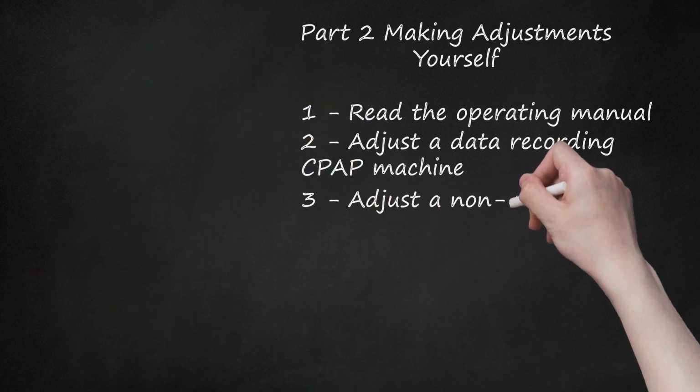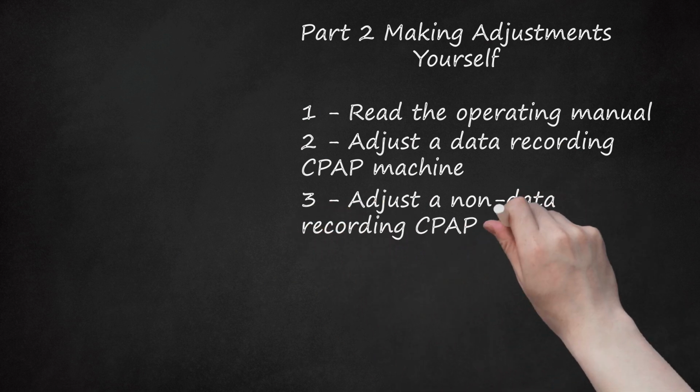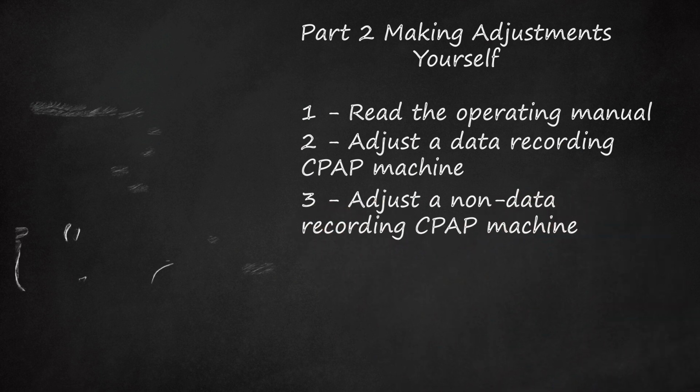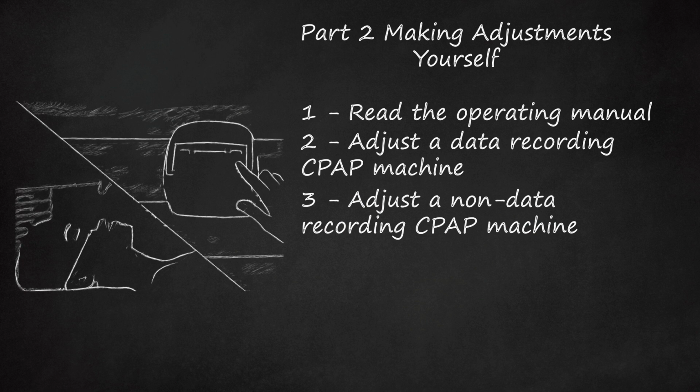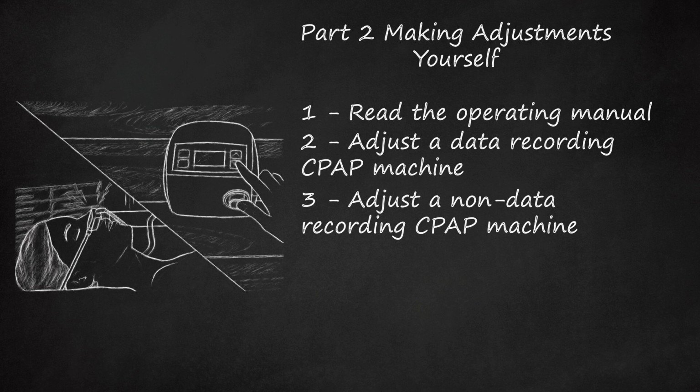3. Adjust a non-data recording CPAP machine. Adjusting a non-data recording Respironics CPAP machine is more difficult because you don't have an objective AHI to guide you to either raise or lower the air pressure. Instead, you must use the very subjective "how do I feel" approach when you wake up in the morning.